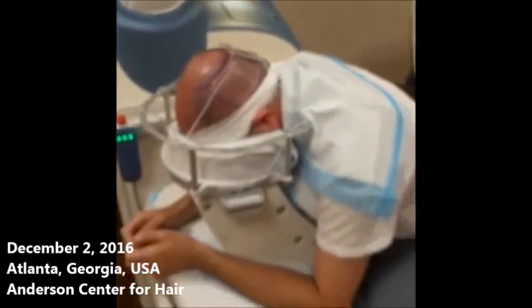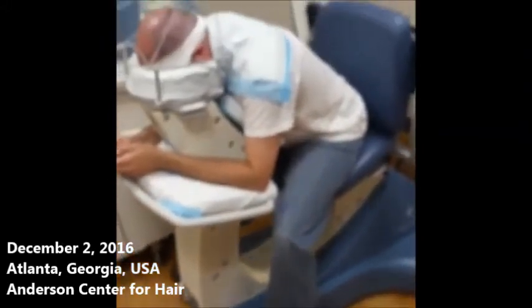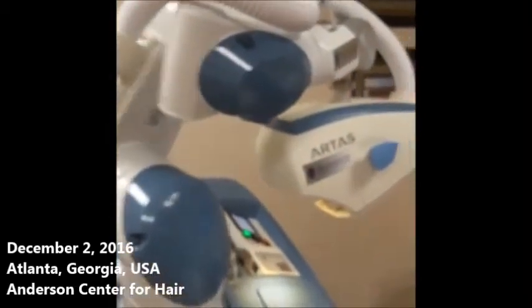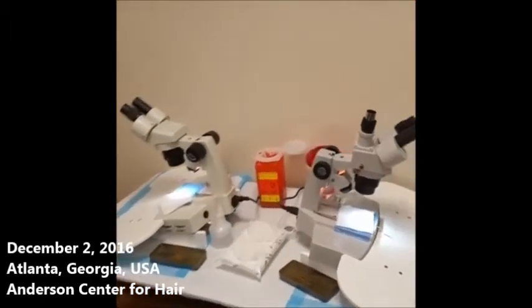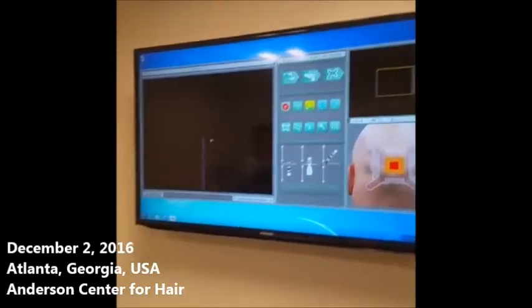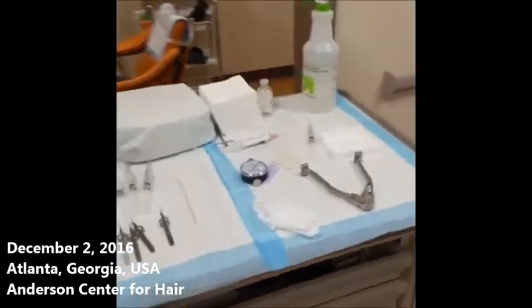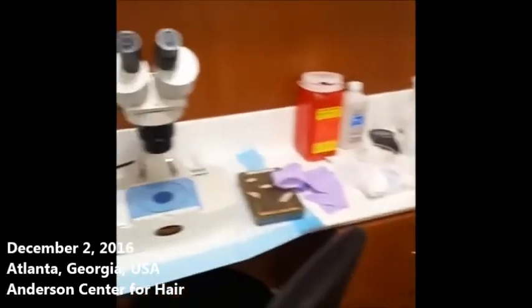Just like yesterday, James is in a very comfortable massage-like chair. We have the six-jointed robotic arm ready to go. We've got our microscopic stations ready to sort, count, and trim the grafts in preparation for transplantation. Our monitor is ready for the team to see what's going on, because they work in concert as a surgical team. We've got our entire cart ready with all the tools we'll need today, and yet another microscopic station.